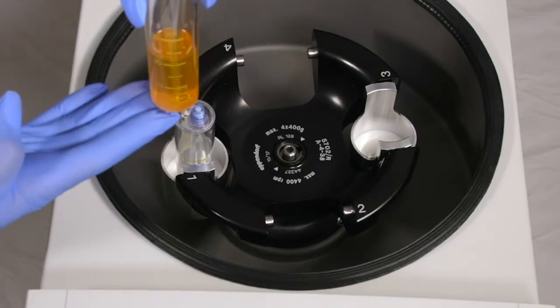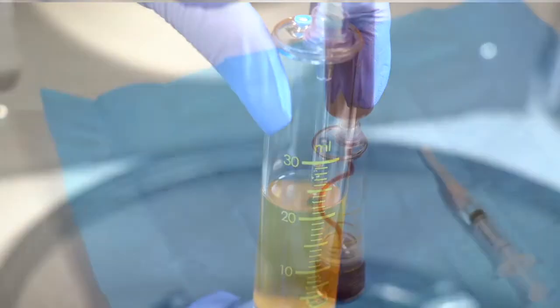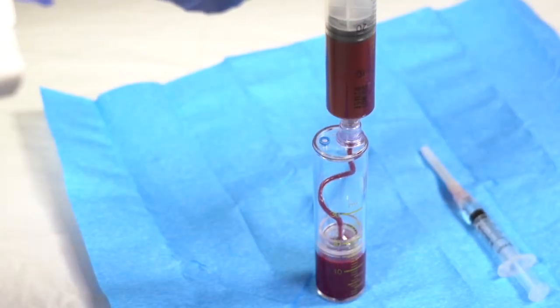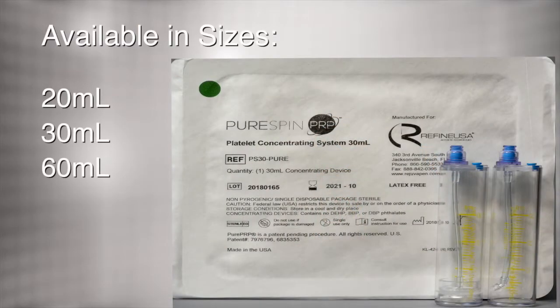The PureSpin's intended use is for the safe and rapid preparation of autologous platelet-rich plasma PRP from a small sample of blood at the patient point of care. PureSpin PRP kits are available in various sizes for all of your clinical needs.